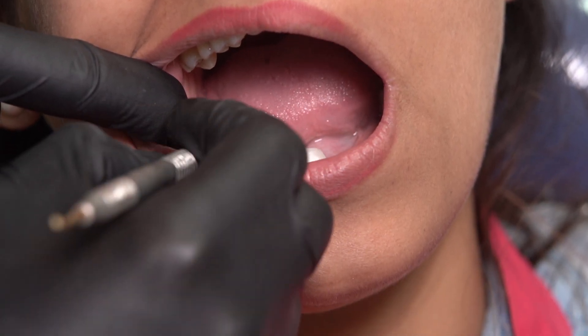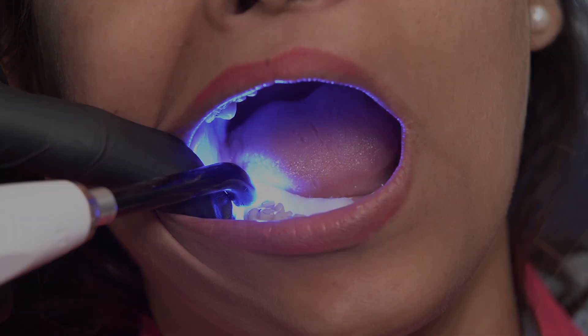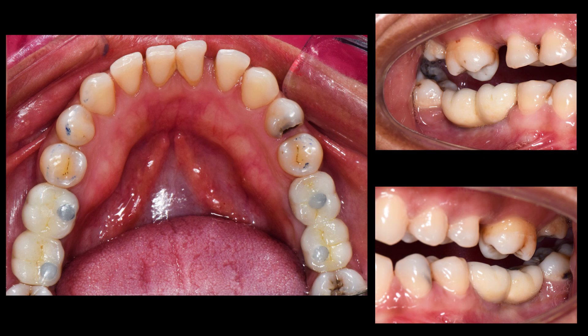After this, it's all just routine work. I can just plug in some composite to block the access hole.